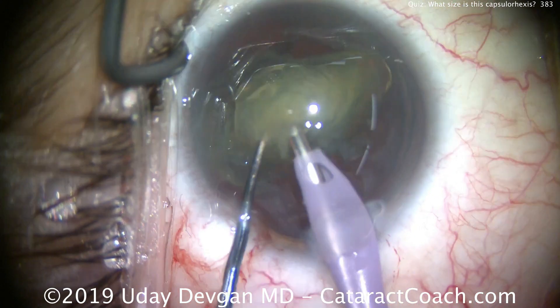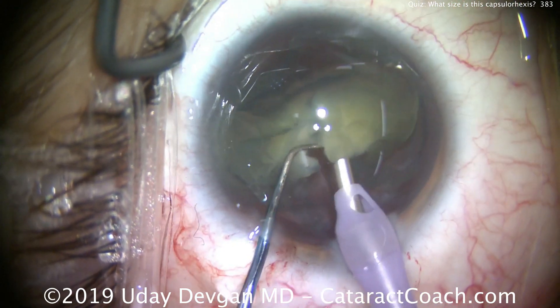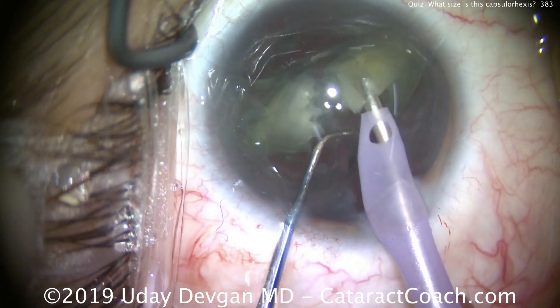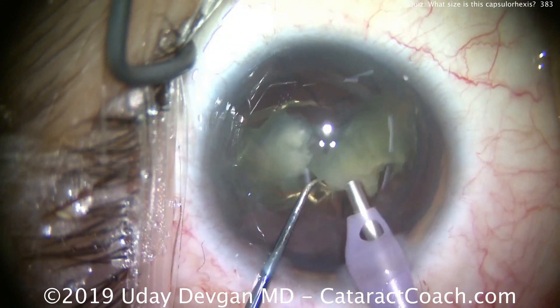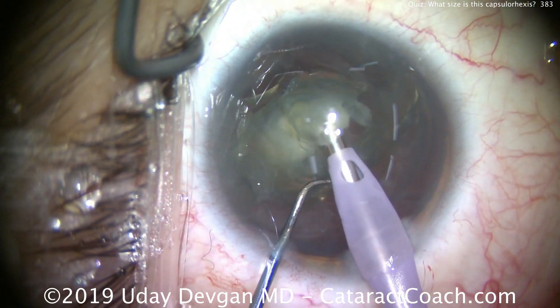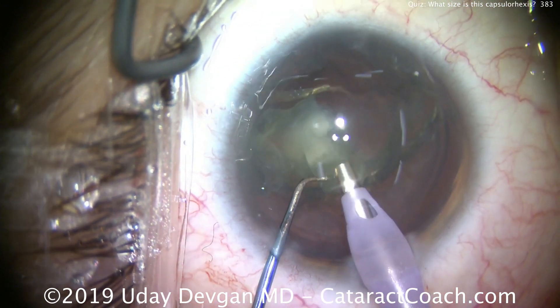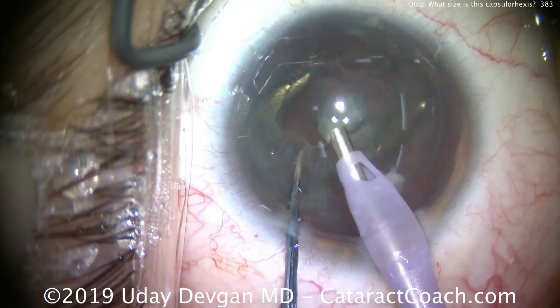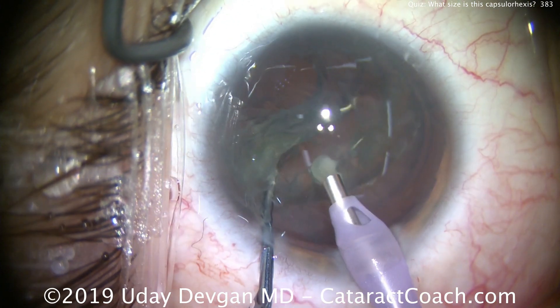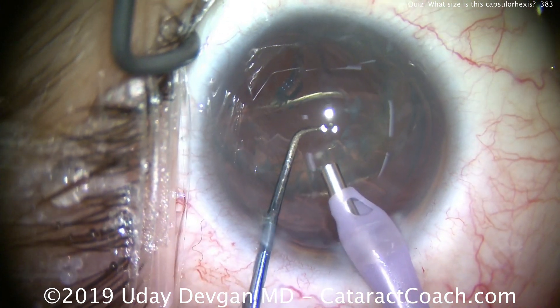We'll chop it up into pieces and emulsify it relatively quickly. In our modern era, these phaco machines have exquisite fluidic control and very precise delivery of ultrasonic energy, allowing us to emulsify the lens in a very efficient manner. There's the remainder of the lens nucleus coming up with the epinuclear shell.